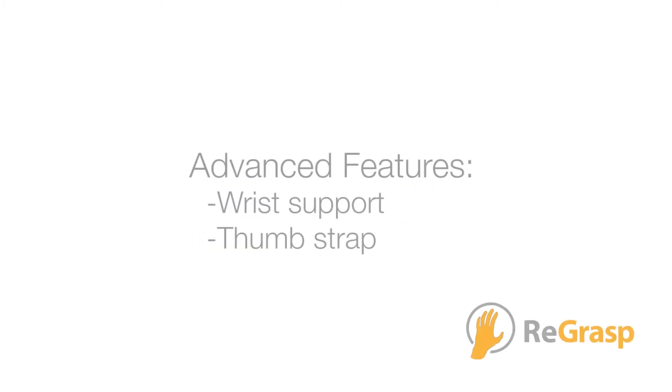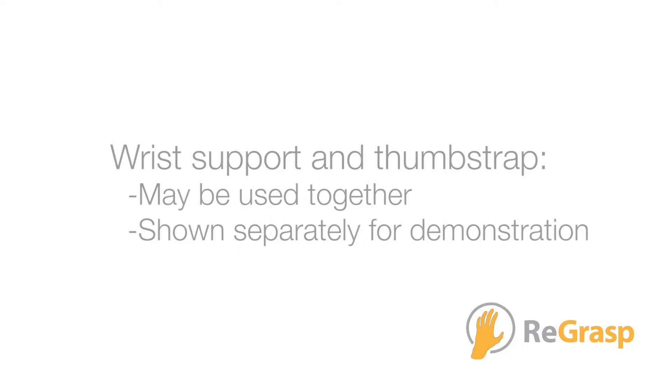In this video, we'll learn how to use the wrist support and thumb strap. The wrist support and thumb strap can be used together. However, for the purpose of demonstration we're only going to show one at a time.